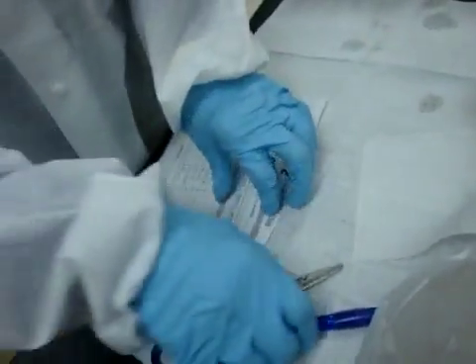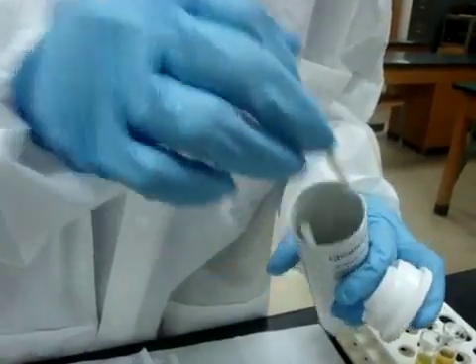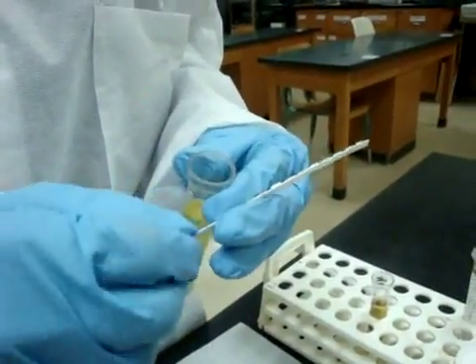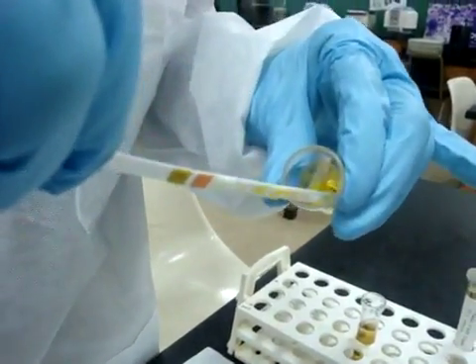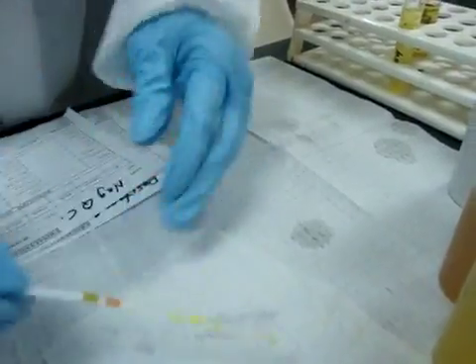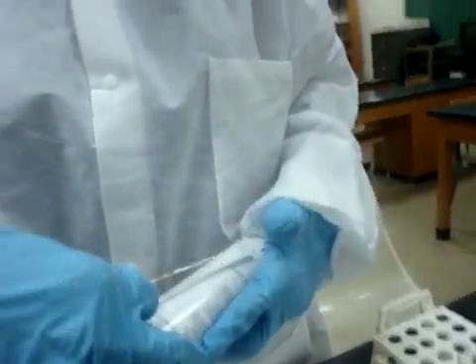Then the first thing I'm going to do is take my negative, remove a stick, cover it. I'm going to take my stick and I'm going to dip it quickly into the urine, and then come straight out and pull it along the lip of the container to get rid of excess liquid, and then put it along the chem wipe to get rid of the rest of the excess liquid.